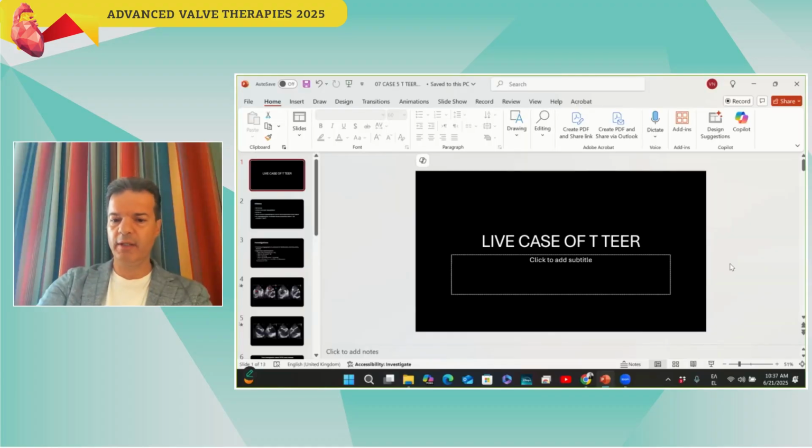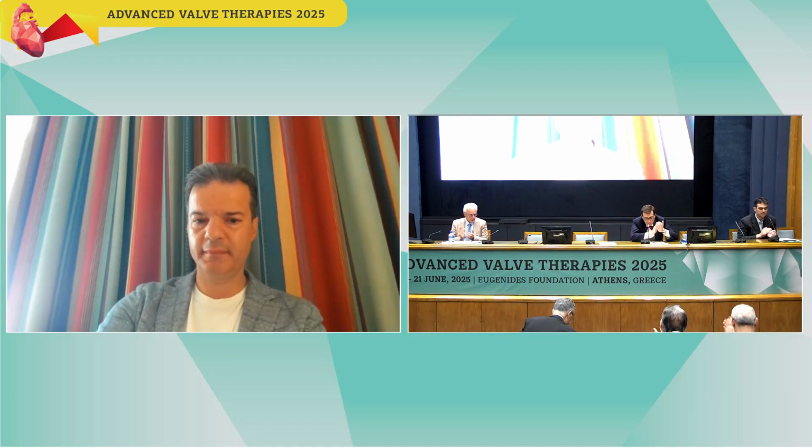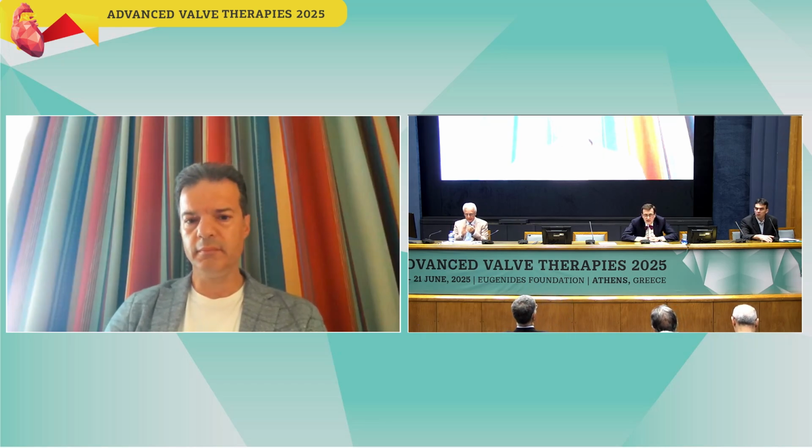Great. That was terrific. Thank you so much. Thank you. That was a terrific imaging and hemodynamic result and very well explained.